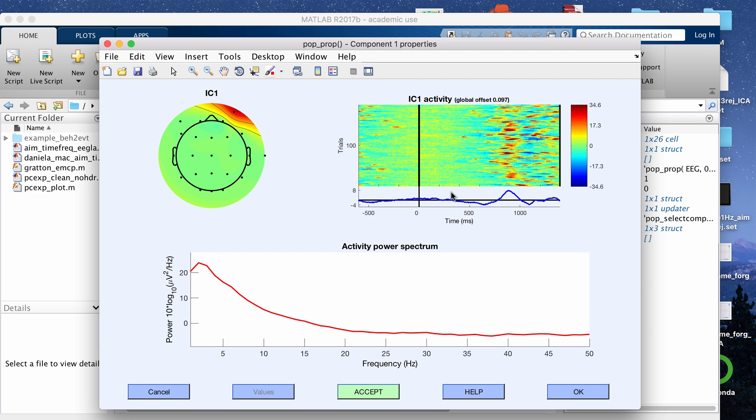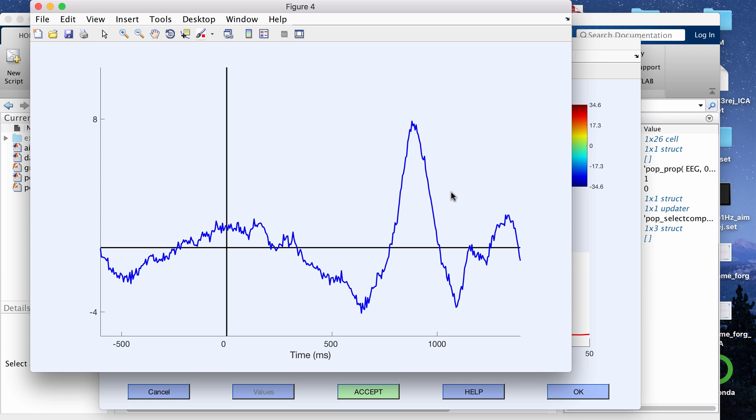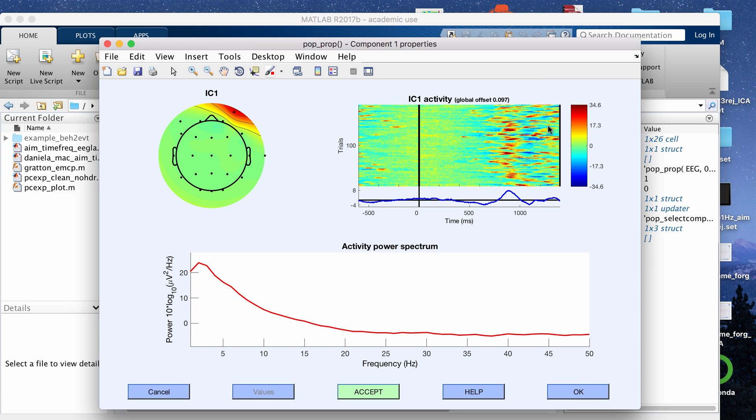If you click on the ERP below the ERP image, it will give you a zoomed up graph of what the ERP looks like. This is the ERP image and this is the power plot like I just said.